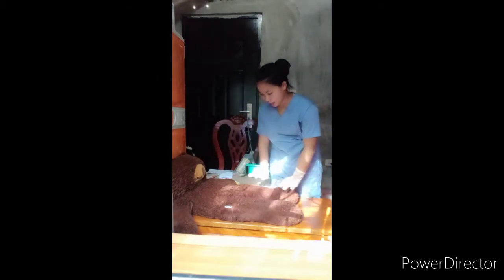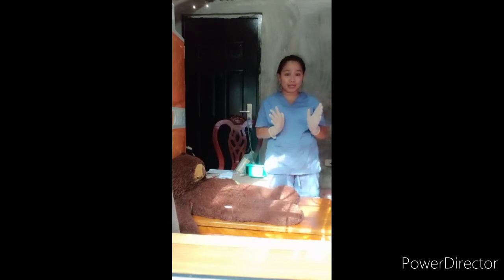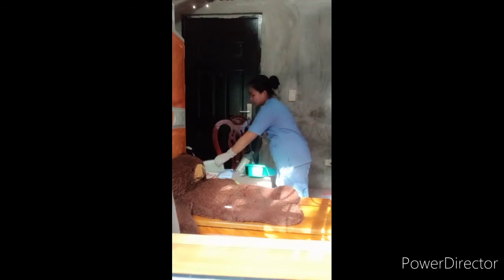Okay, proper height. And then next, let's connect one end of the tubing to the suction machine and place the other end near the patient, then turn the device on. Let's set the suction pressure as low as possible, and let's occlude the end of the tubing to check pressure. So first, let's open the suction machine, and then next, let's connect the tube.